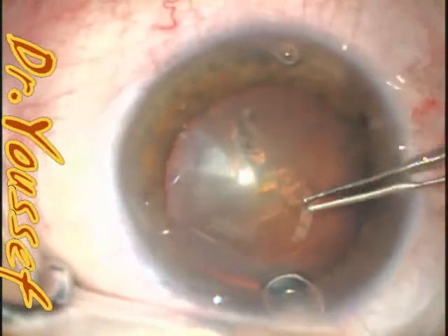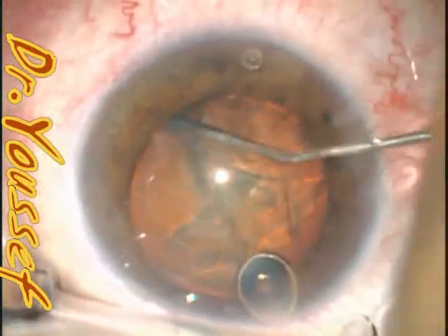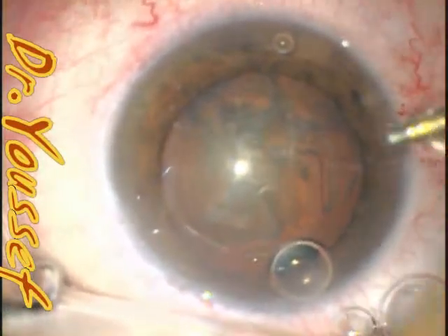In this case, it was discovered that the lens was a little bit to one side, and you have to make sure that this haptic is in the bag, not in the sulcus. Otherwise, it results in pigment dispersion and glaucoma and uveitis sometimes.